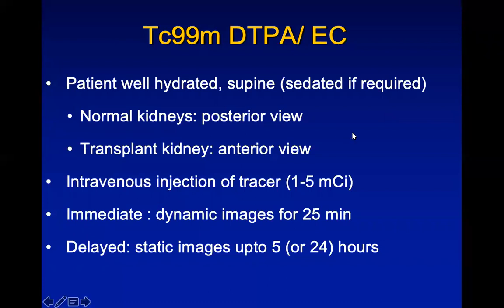Once they know that there is only one IV injection to be given, initially there might be a bit of resistance, but after the single IV injection, the patient just has to lie there for about 25 minutes. If the patient is not cooperative, then sedation might be required. Usually we use oral sedation only.